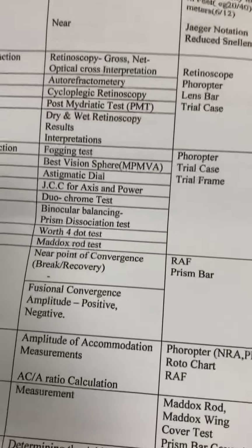For example, this one. If this print is given to you, and you are asked to tell the whole details about it, then you should know how to. Yes or no? Yeah. So what is this? This is the sphere of the right eye. Cylinder, meridian. And what is this? Left eye.